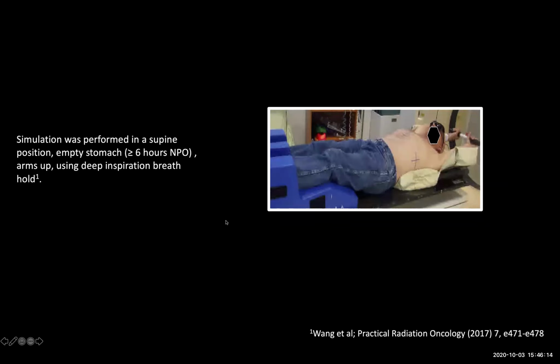That's how we simulate. The patient is in a supine position. We would like an empty stomach more than 6 hours. Although whenever you say empty stomach NPO, not necessarily it applies the same to everyone. There are patients who are diabetic. There are patients who are mouth breathers. So therefore, attention has to be paid to these particular patients. So whenever you do the CT sim, please check the stomach to see if it is completely empty.